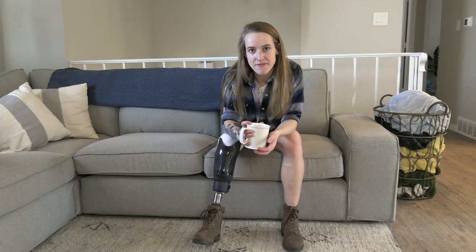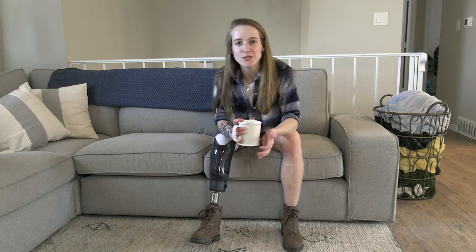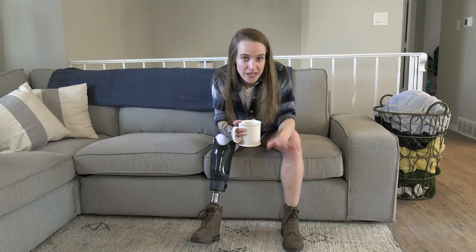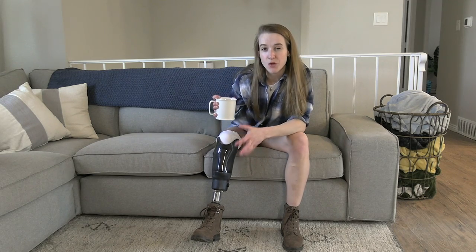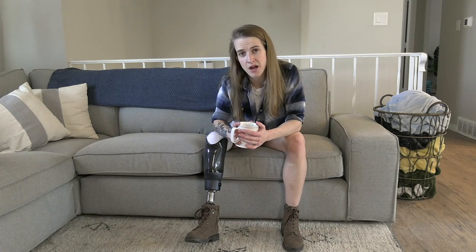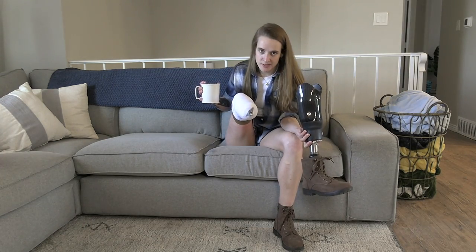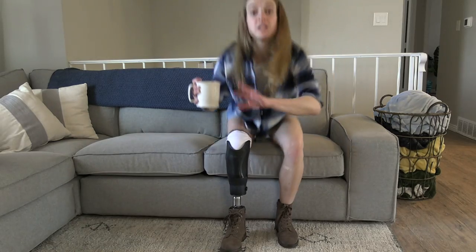Like, the suction system that I've had before has worked in so many ways really well for me, but I kind of got to a point where I was really tired of the continual small problems that I was running into. And kind of like Trace, my prosthetist who you saw in this video who was making this one for me, was saying, this is kind of like the all-terrain model. Like, if I was going to be stuck in a zombie apocalypse, this is the kind of layout I would want because it is a very simple system. There are much fewer parts that break, it is much more durable. It's just step in and go.